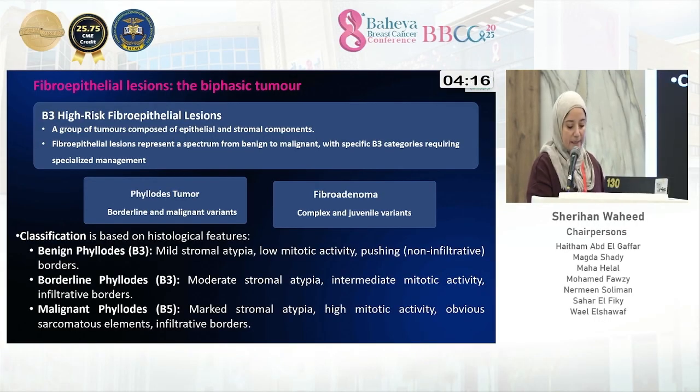From a clinical perspective, the most important red flag that you'll hear from a patient or see on prior imaging is rapid growth. On ultrasound, they can mimic a fibroadenoma. However, you should be suspicious of any large growing mass, especially one that shows heterogeneous texture or cystic spaces. Describing these features specifically in your report is crucial.